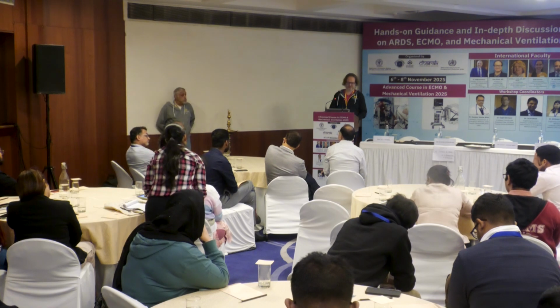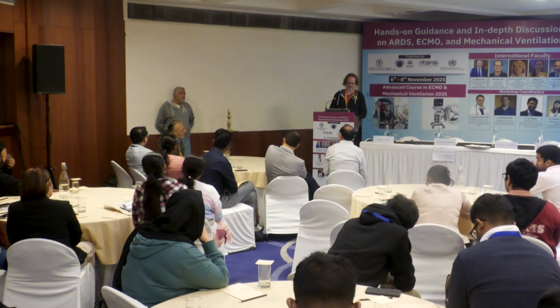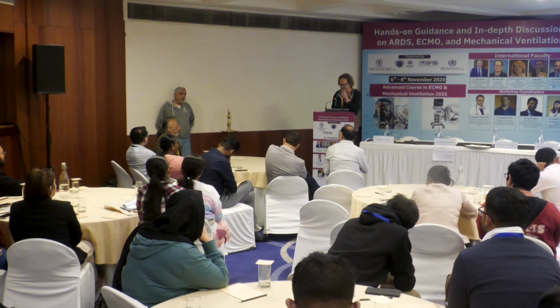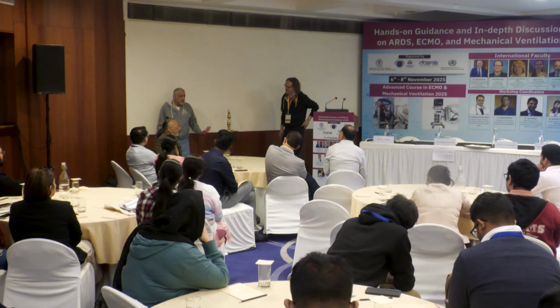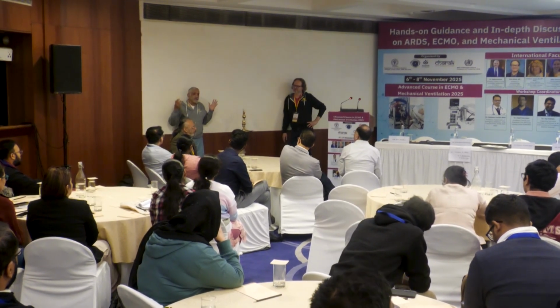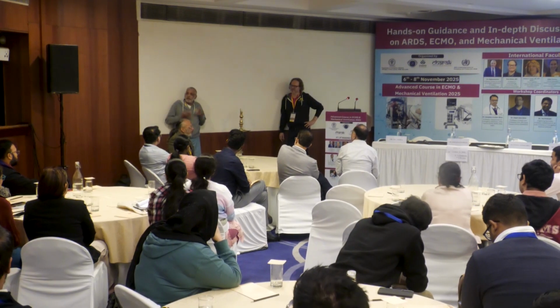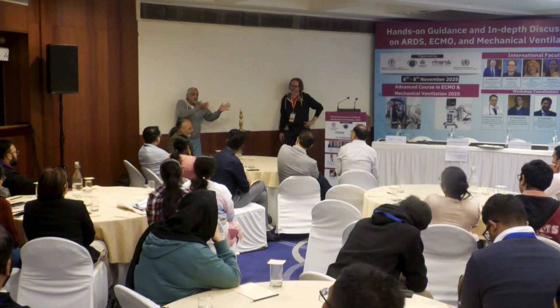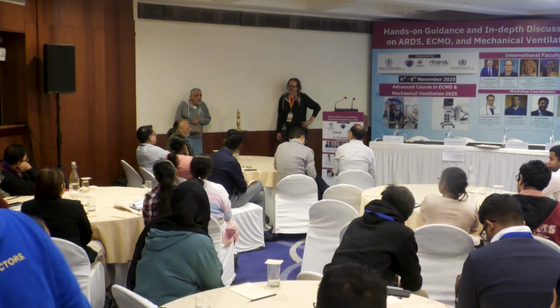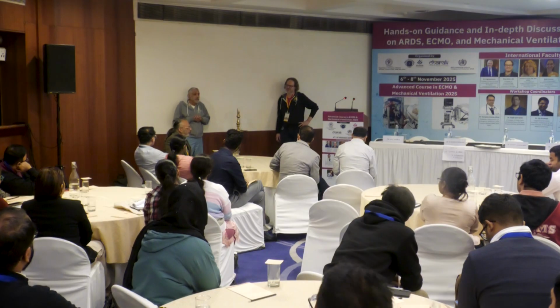Ideally, it should be done in the cath lab, but the cath lab has no availability. They are too busy with their own work. So if the patient is sick, it is done at the bedside. We used to do fluoroscopy, but later on we were told that in our ICU we have no radiation barriers between rooms, and somebody made a big deal of it, and then we stopped doing fluoroscopy. So we routinely just employ plain X-ray. We measure approximately, and we use a long multi-stage cannula, which we'll talk a little bit about.